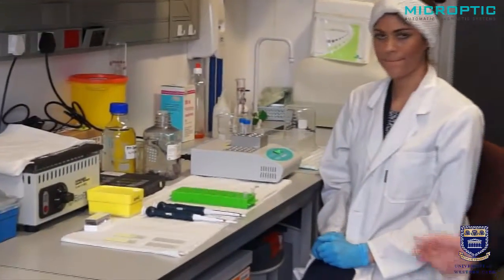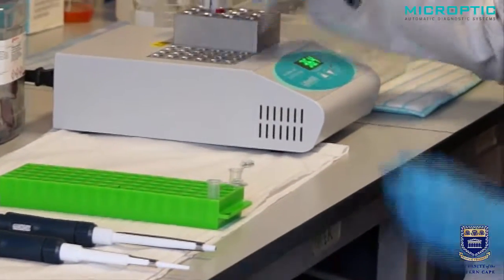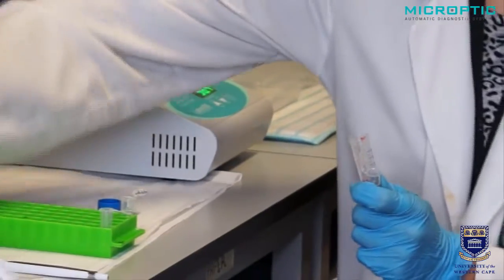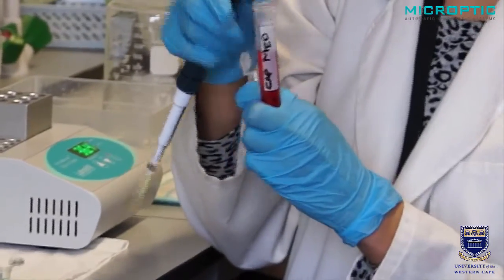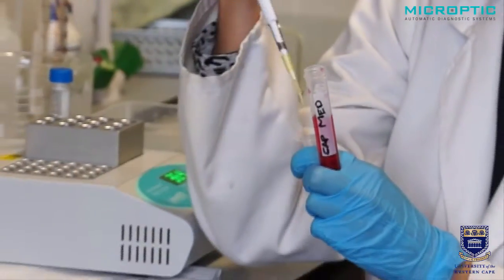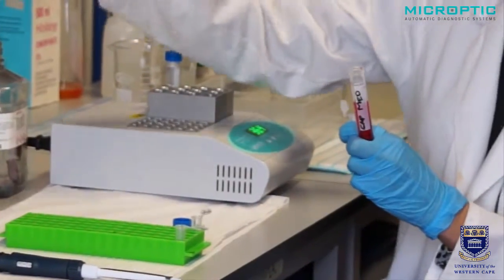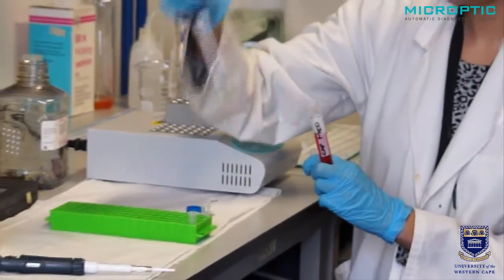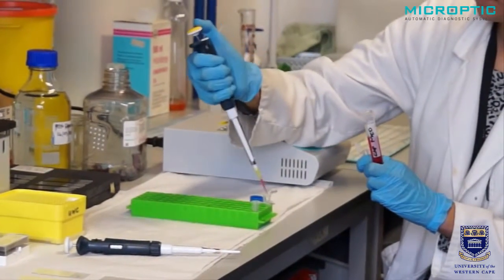Why two? One is for the control and the other one is for the acrosome reaction. First of all, we take a semen sample and dilute it ten times in a typical capacitating medium of your choice.